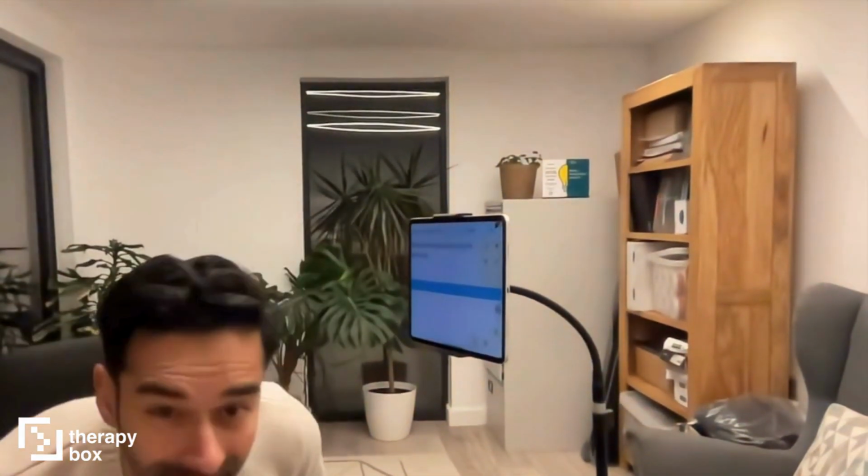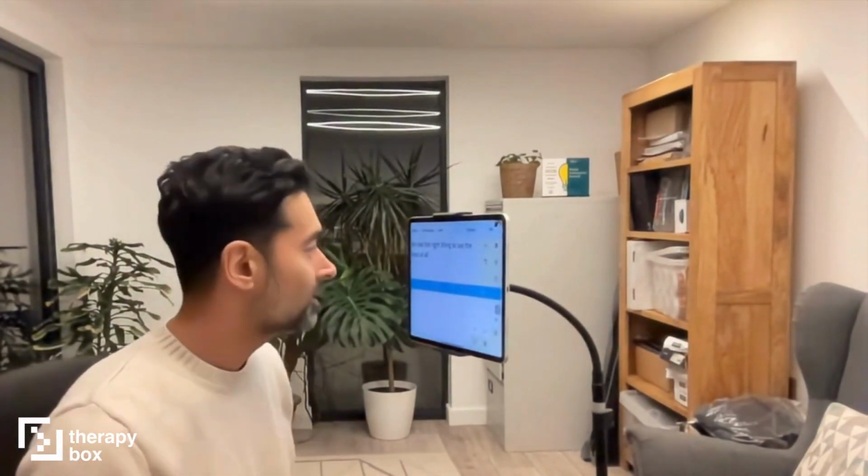This is nearly impossible for an eye tracking device to do just because of the technology that is being used. So that's a little bit about how head tracking works. It's very, very flexible, very reliable, very stable, and you can use a bunch of different selection methods that are otherwise not possible.